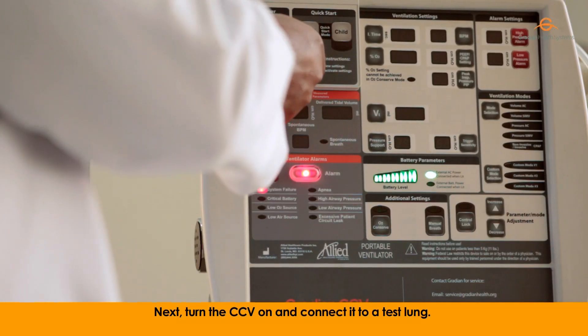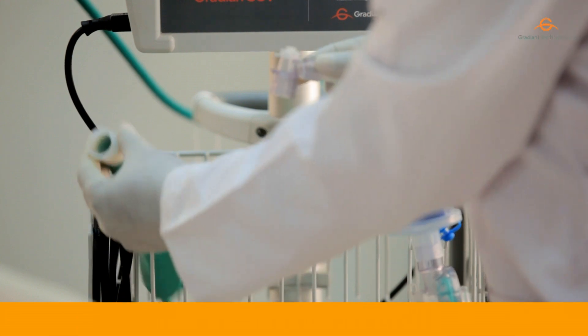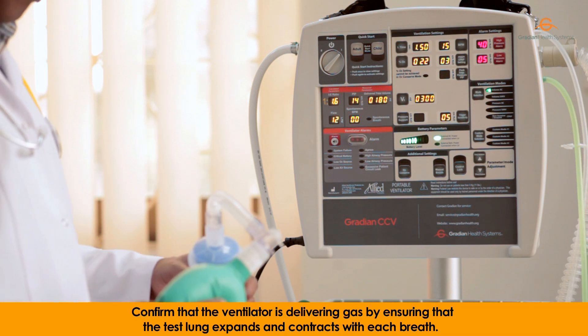Next, turn the CCV on and connect it to a test lung. Confirm that the ventilator is delivering gas by ensuring that the test lung expands and contracts with each breath.